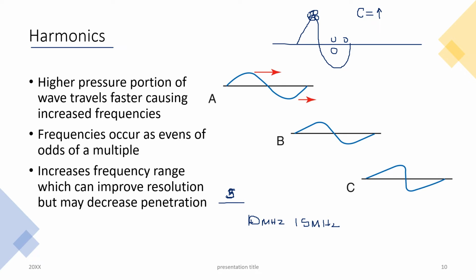I know for one, in my scanning, if I'm scanning a fetal heart, oftentimes I'll want harmonics off. Whereas if I'm scanning an adult gallbladder, I'll definitely usually want it on because it helps reduce artifacts. So it's one of those things that you want to play with quite a bit until you identify your preferences.